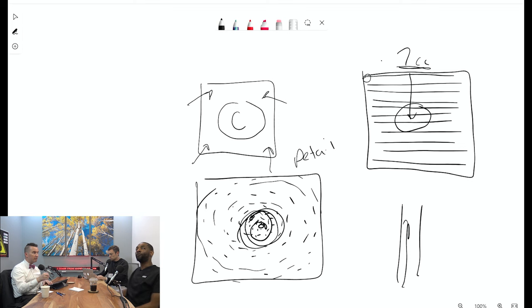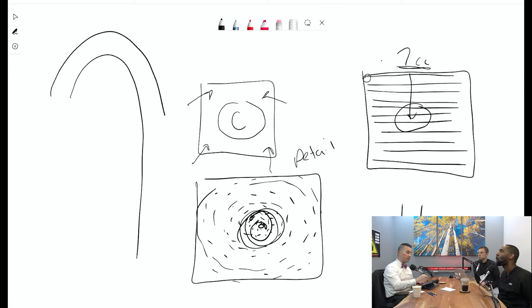If you had extended coverage, maybe aorta or something, maybe we can do carotid still. Would you still use elliptical? Oh yeah, still. But I would start to think about having my bolus last longer. For a carotid, I'm trying to get the candy cane, right? So I need to wait.